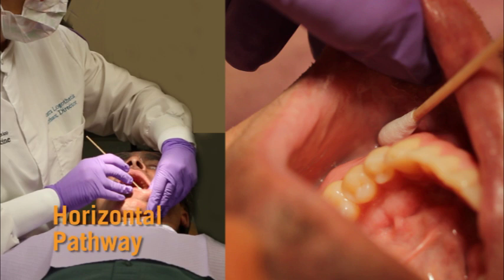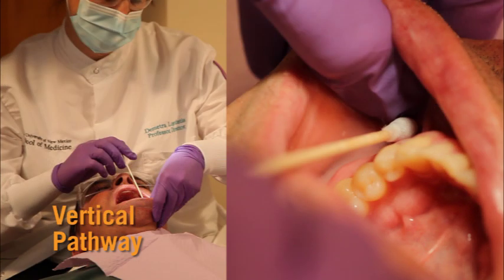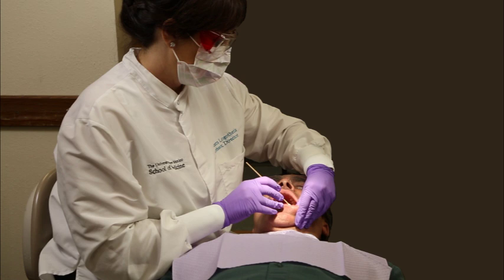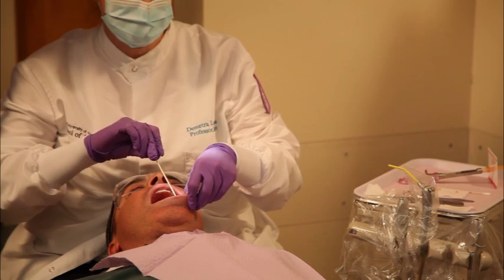Currently, there are 2 pathways or methods by which these nerves can be anesthetized: directing the syringe barrel horizontally or vertically. Although both techniques provide the necessary anesthesia, the horizontal pathway is preferred because it keeps the syringe out of the patient's line of sight and offers a direct view of the large window during aspiration. Determine the syringe approach and assume the correct operator positioning at 8 o'clock right side or 9 o'clock left side for a right-handed clinician, or 4 o'clock right side or 3 o'clock left side for a left-handed clinician using the horizontal approach, or 12 or 1 o'clock using the vertical approach.